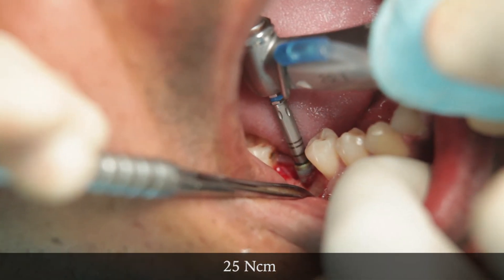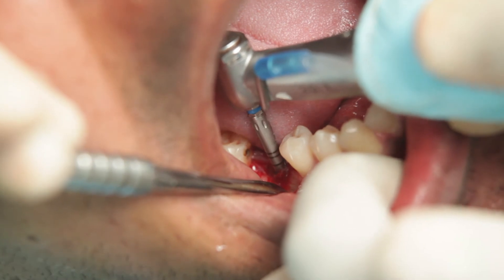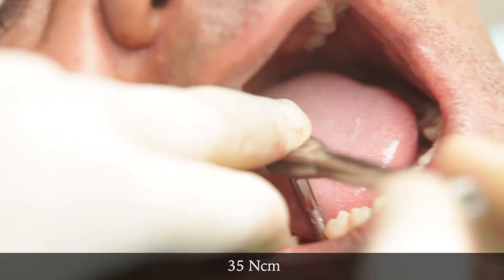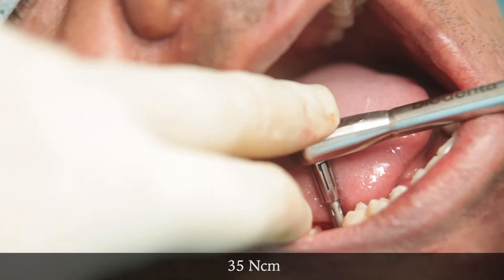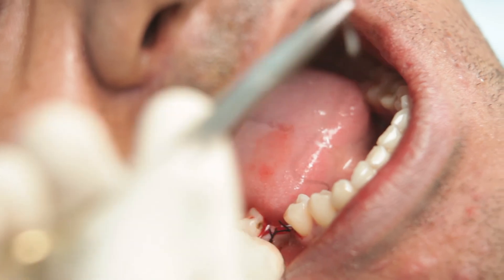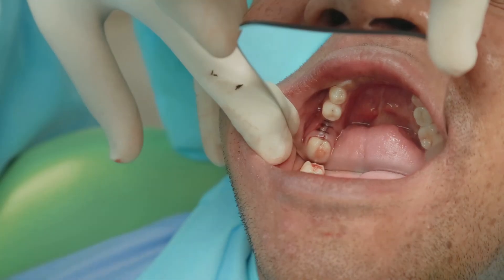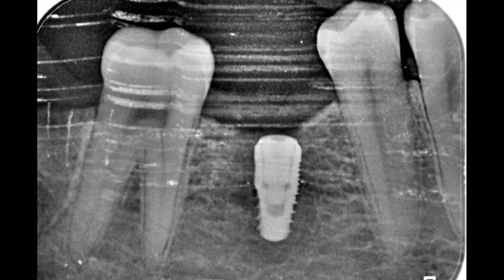The torque on my physio dispenser has been set to 25 Ncm, and you can see that it is breaking as I am exceeding the torque value. I shall now move over to the torque wrench and set it to 35 Ncm. I can feel that the wrench is breaking again, which means that I have a fixation torque of 35 Ncm. The cover screw now goes in and I will suture the flaps back using interrupted sutures. This is what the post-op IOPA looks like.